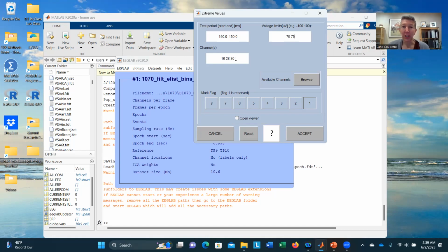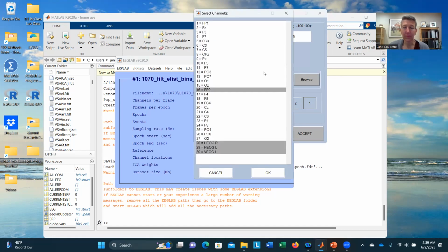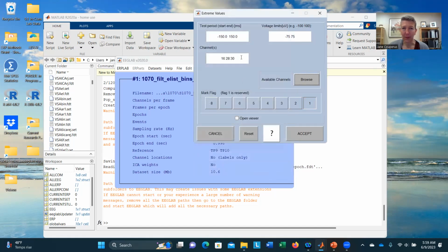And then you have to decide what channels. So to look at what channels you have available, you can click Browse. I have gone ahead and picked my ones that are my eye channels, but you might decide to do other ones as well. I'm going to go ahead and repick the ones for the eye channels. To select multiple things, just use Control. So FP2 is my upper eye. I'm going to use my right and left as well as my lower eye as well. And then I'm going to click OK, and that will populate these numbers. You can change these numbers manually as well, but I just tend to use the browse.